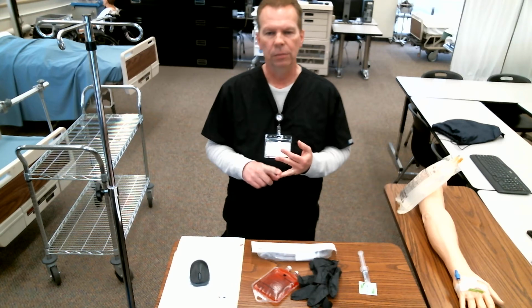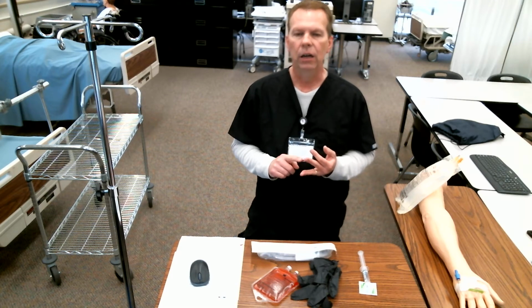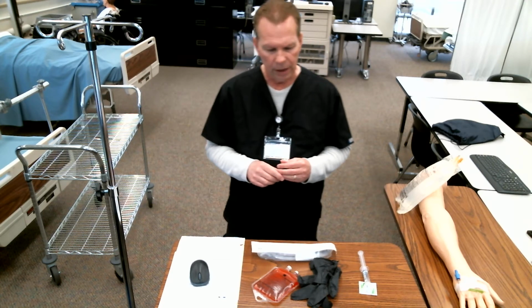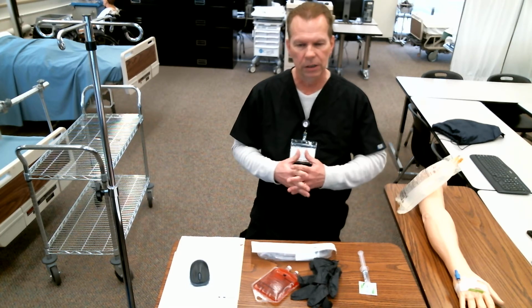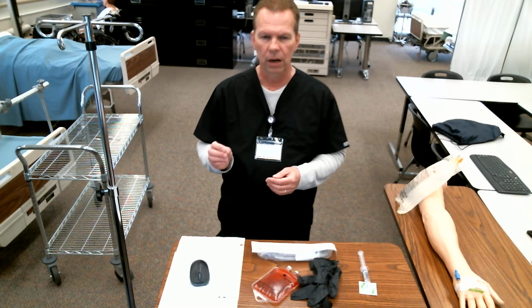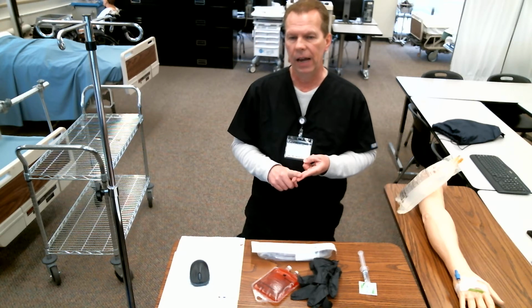You have a maximum time limit of 4 hours to get blood in. If this blood product that you hang goes over or starts to go over, we're not going to let it go over 4 hours. If it starts to go over that 4 hour mark, you've got to stop it, and then notify the physician how much was left and what caused it to be slower or whatever. So you want to make sure that you know how fast you're supposed to put it in, but you have a maximum length cutoff time of 4 hours. So that's number 1.